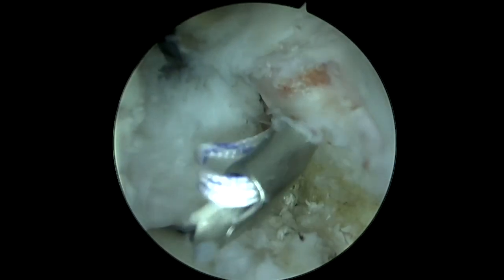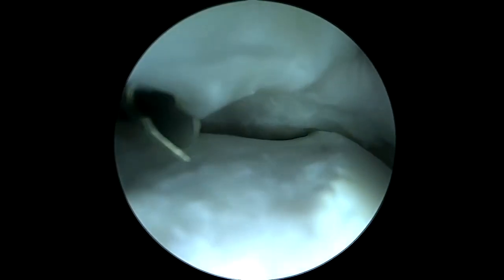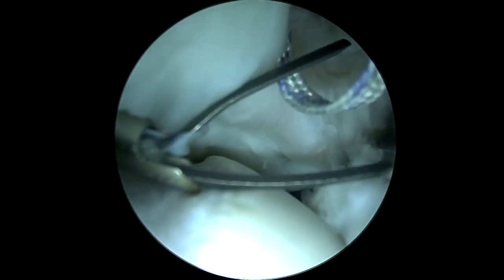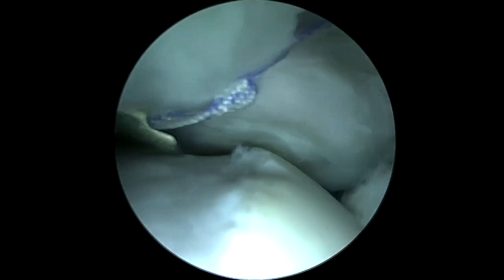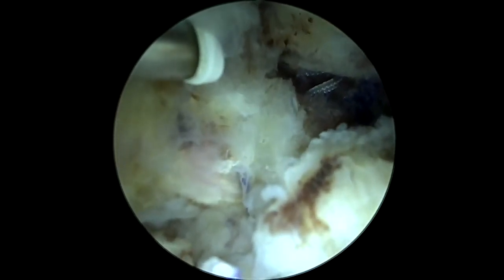After completion of the femoral osteochondroplasty, the interportal capsulotomy is inspected. If capsular redundancy or insufficiency is noted, it is recommended to perform capsulorrhaphy of the anterior capsule to prevent joint instability. Multiple suture tapes are passed through the acetabular cuff of the interportal capsulotomy with a 70-degree suture passer, and then retrieved through the distal cuff, tensioned, tied, and cut. Capsular closure is considered satisfactory when the femoral articular cartilage is no longer visible.